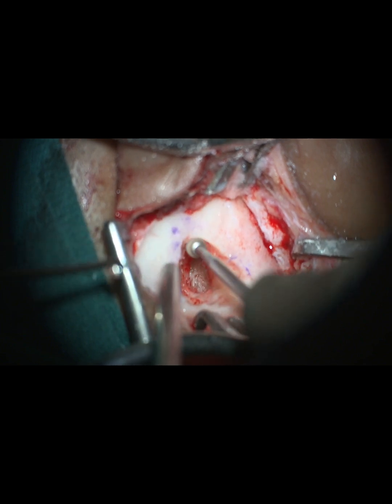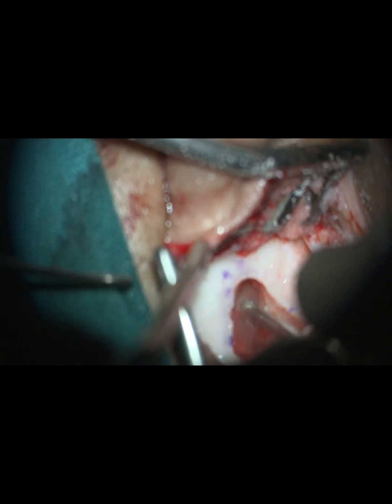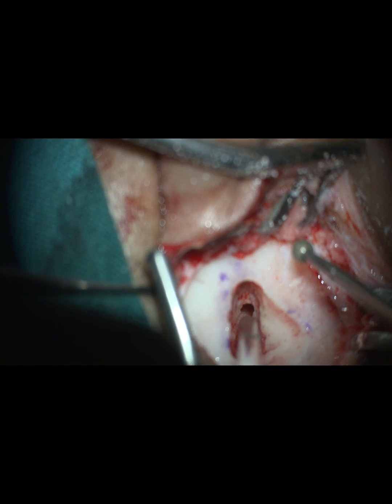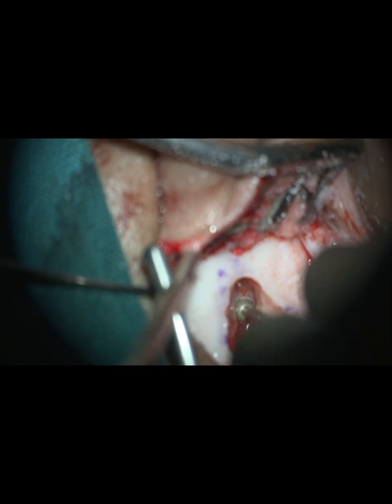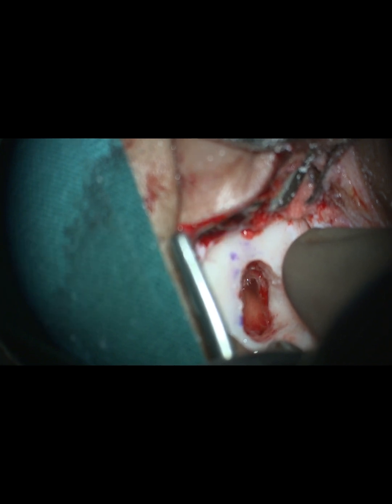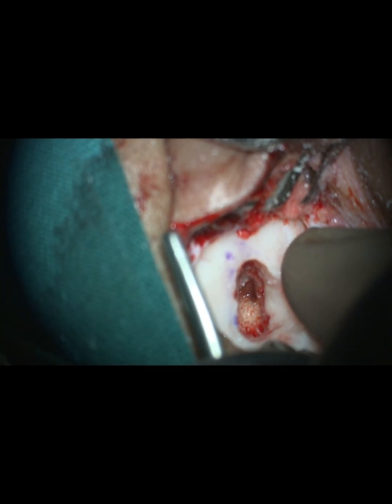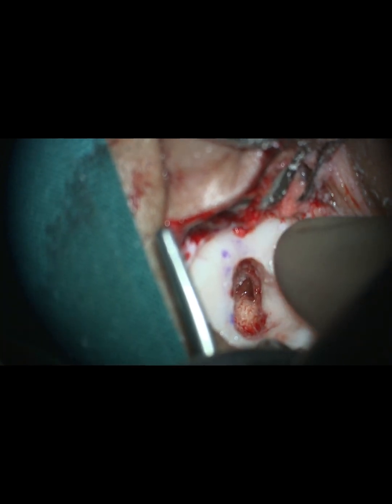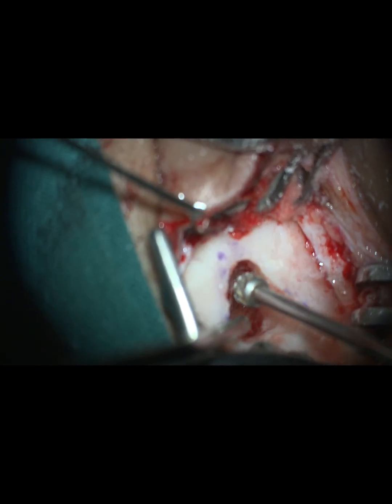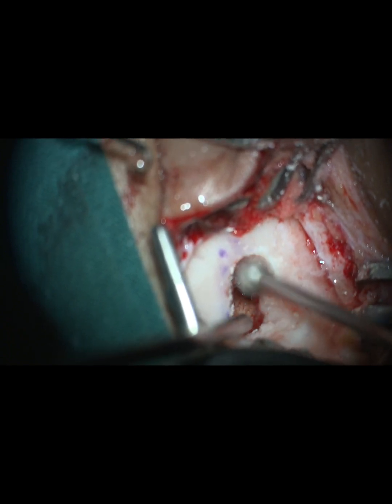You can see the mastoid being opened, the antrum being opened, and now we plan to follow the attic and aditus and attic anteriorly. You can see with the water drops, we can have a view of the incus coming due to refraction, and this gives us an idea that the ossicle chain was intact. So we know exactly where now the canal will be. Starting the drilling towards the canal now.